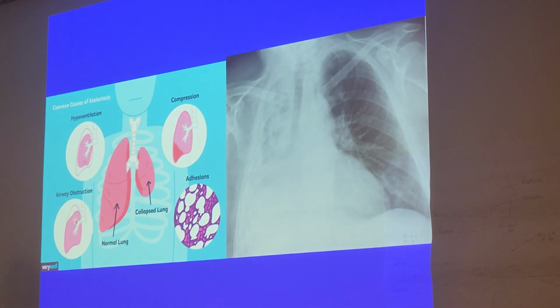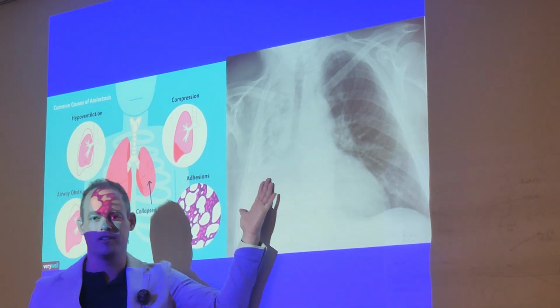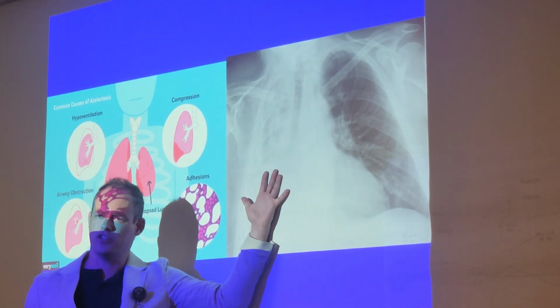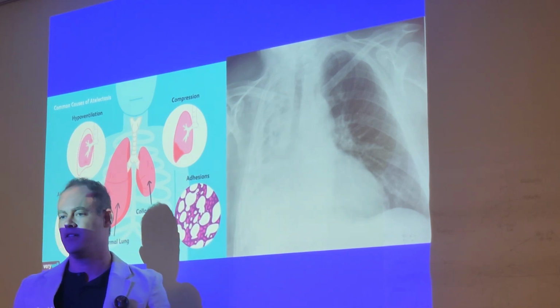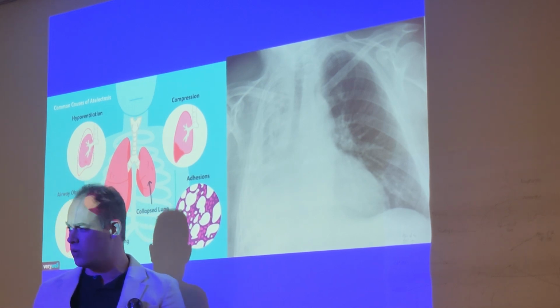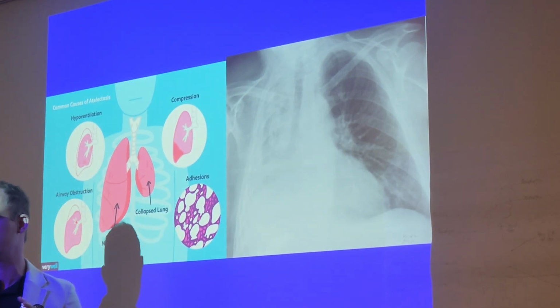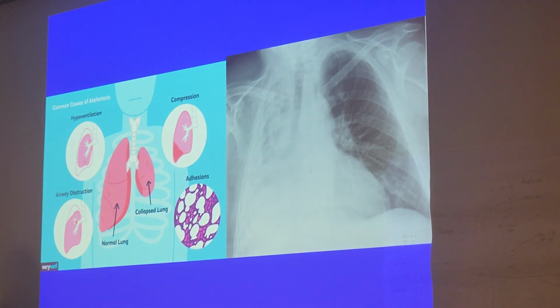All right, so whoever said decrease, why would you decrease it? There's a lot of air in the lungs, so it's easy to penetrate. Basically correct. It's easier to penetrate. So the lung's collapsed. The tissue's not there. So if there's less tissue, we're going to decrease the mAs because there's less to actually penetrate. Versus if there's more tissue there, we're going to increase it. So you're going to see a lot of situational questions like that. Because another one we talk about in a minute, I'm going to quiz you the same way. Think about how much tissue is there, how healthy the tissue is, and that's how you're going to determine if you raise your mAs or decrease it. They actually give you a lot of questions like that. You're going to have some of those on your next test as well.